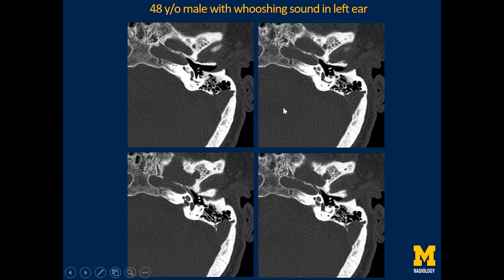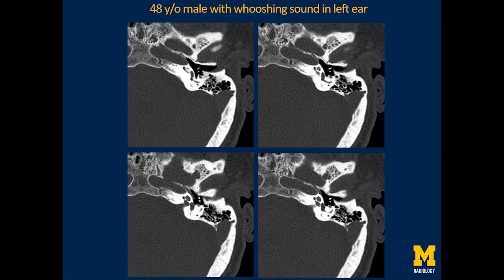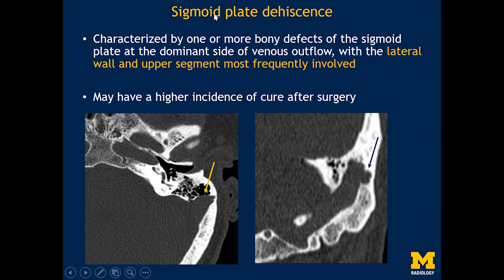Here is a different patient with a whooshing sound in the left ear. The jugular bulb was not high-riding and there was no dehiscence — so is this a normal scan? Before you close that study, pay particular attention to the sigmoid sinus where it changes orientation from horizontal to vertical. It should always be covered by bone, and that covering is missing here along the anterior aspect. Blood flowing through this structure will show pulsations transmitted into the mastoid and then the middle ear cavity — this is called sigmoid plate dehiscence, a commonly under-recognized cause of pulsatile tinnitus. It is important to recognize because it has a higher incidence of cure after surgery.